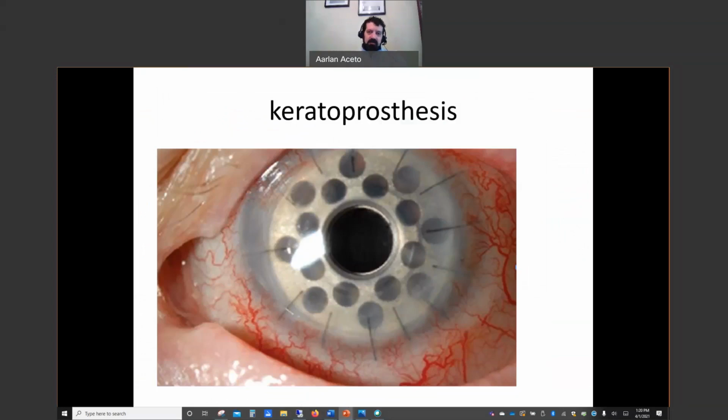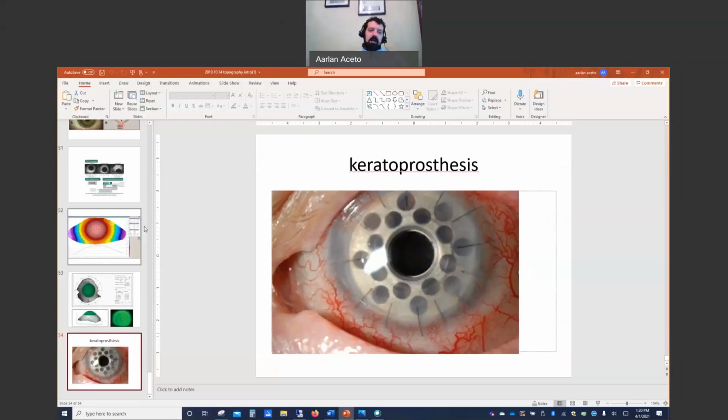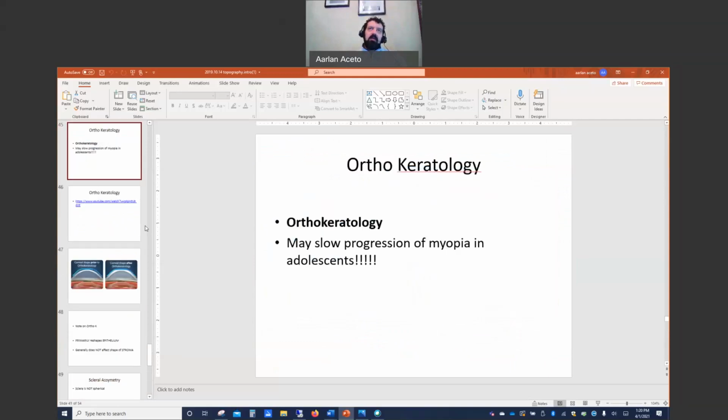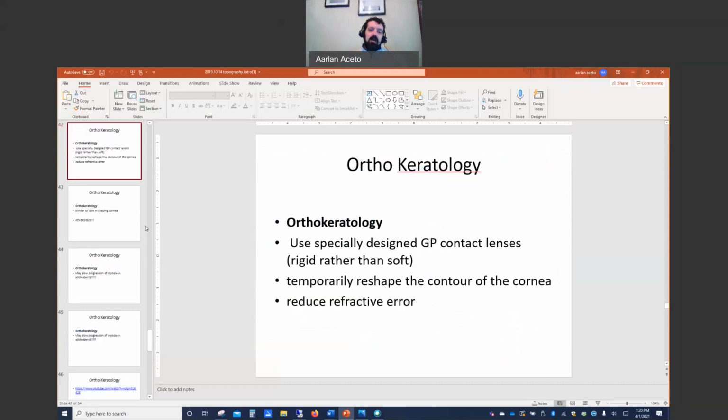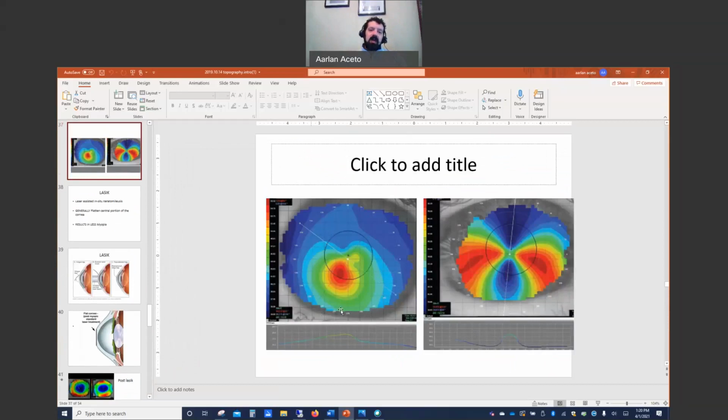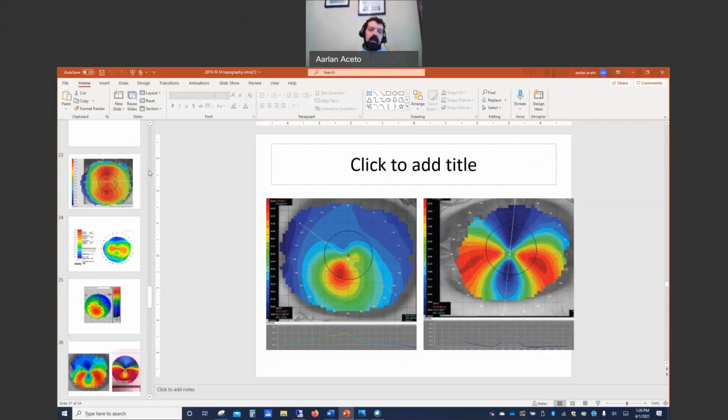but I just wanted to go over the basics with keratometry, the basis of topography. And again, some of the take-homes are, if I were to give you a reading, you should know that the curvature of the cornea flattens to the periphery. You should know how ortho-K or LASIK will make somebody less myopic. I should be able to show you a picture of either keratoconus or the kissing doves or butterfly shape of a pellucid marginal degeneration, and you should be able to identify it.